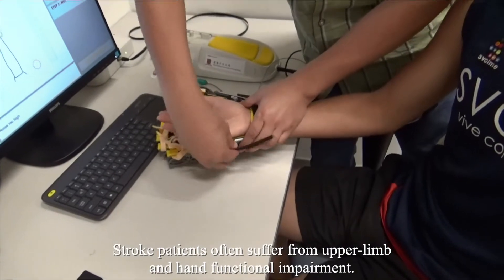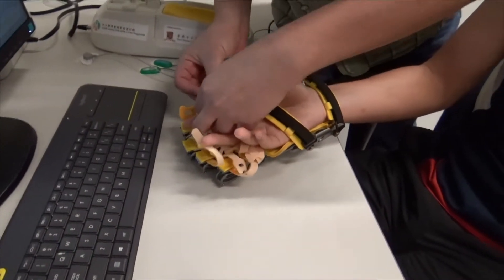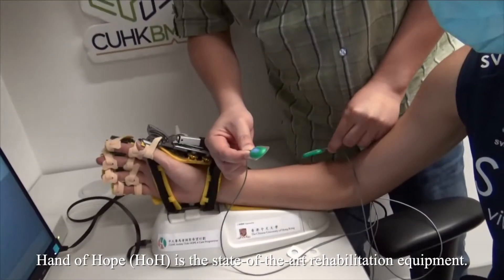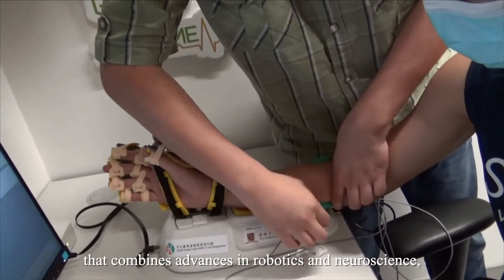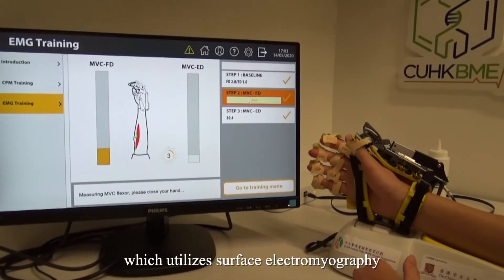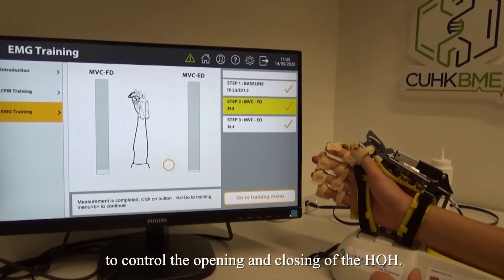Stroke patients often suffer from upper limb and hand functional impairment. Hand of Hope is a state-of-the-art rehabilitation equipment that combines advances in robotics and neuroscience, which utilizes surface electromyography to control the opening and closing of the Hand of Hope.